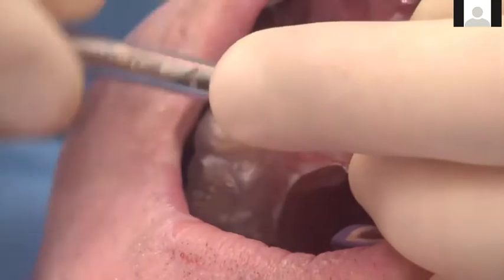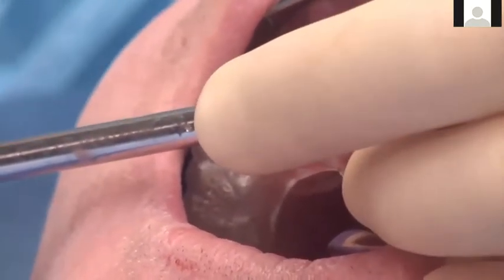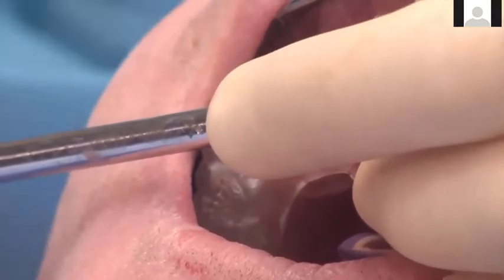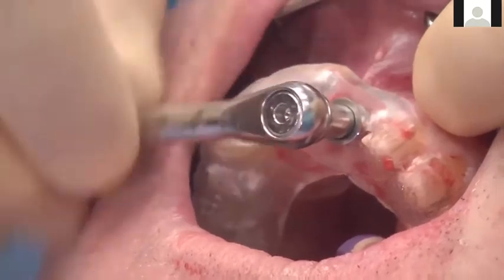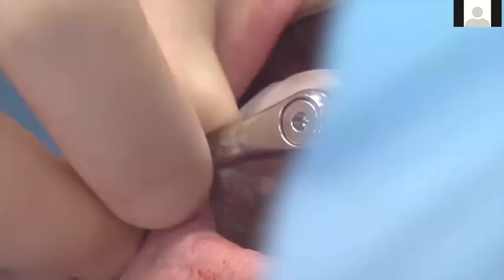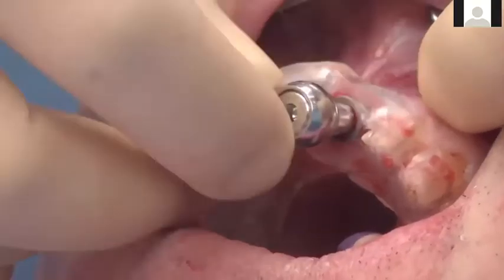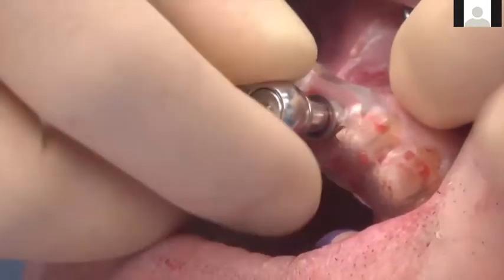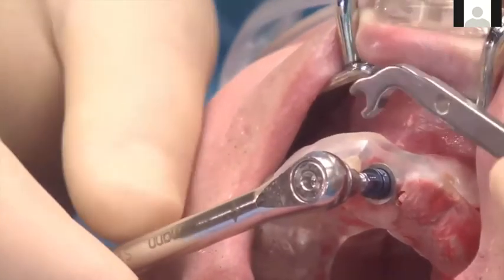So you can go ahead, we can see that we are ratcheting in this implant again deeper to full depth, because remember, we drilled deeper than what the protocol that we had originally planned, because there are always discrepancies, especially in anterior areas as far as depth goes when you plan them in the CT scan. So always double check during surgery. Sometimes you may get it right according to your plan, but sometimes you don't.